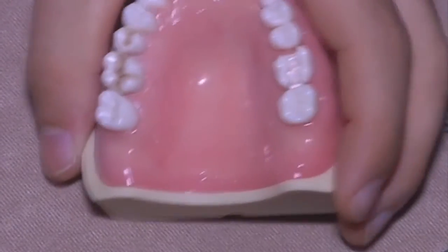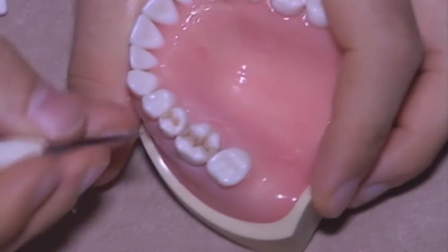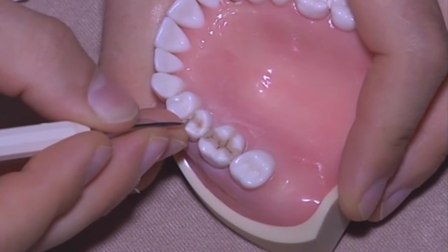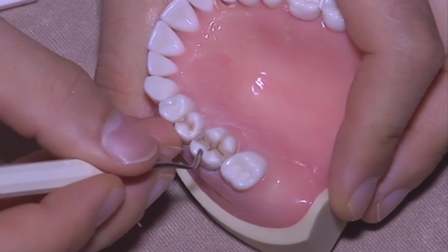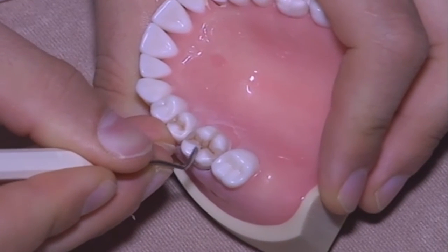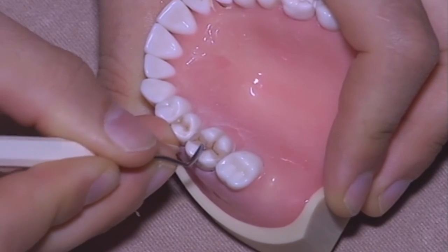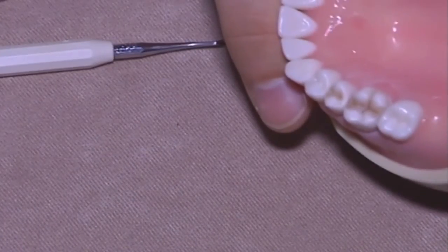So this is a simple step-by-step procedure to perform 2 restorations or 1 restoration. It depends on the case you have, with which you don't need then to spend a lot of time for occlusal check.